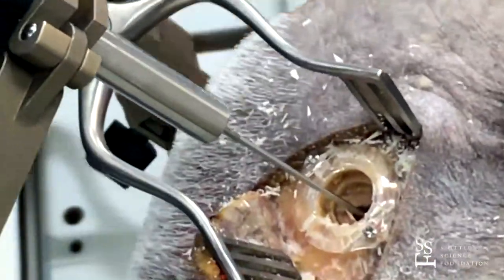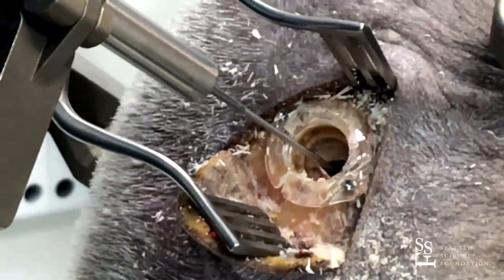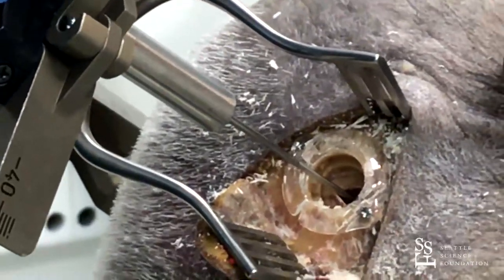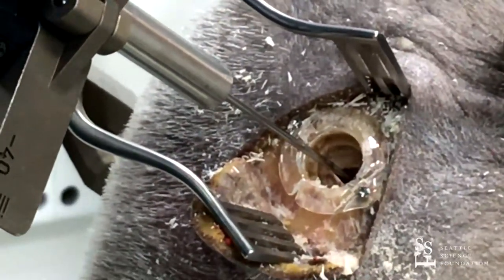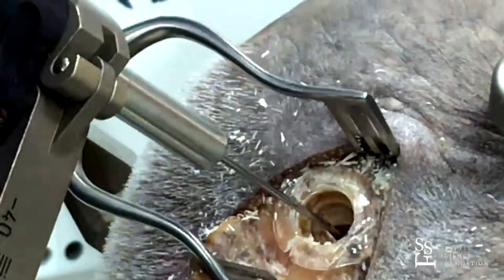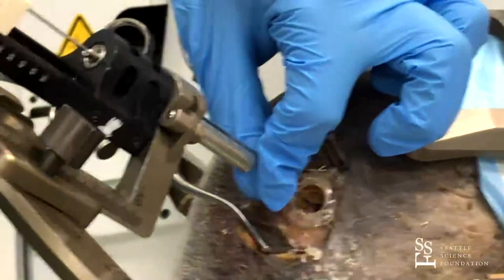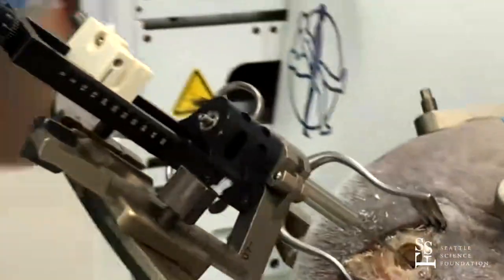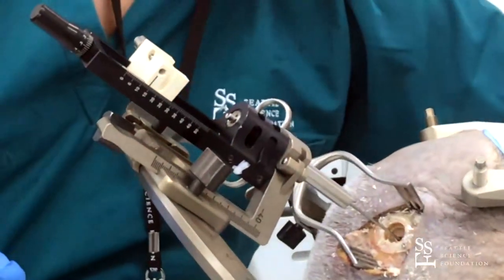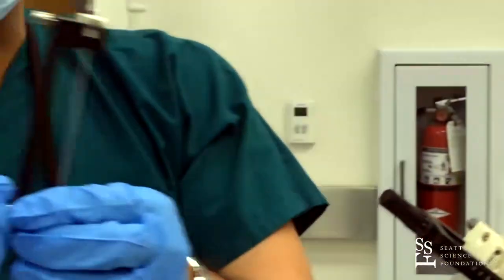Sometimes the pia can be like cellophane and can really deflect as we try to pass the cannula, so it's good to get sub-pial with electrocautery. Now that we're open, we're going to place our cannula to target. I'll usually use a Penfield one for this step and advance it further. When we do this with recordings or awake, the cannula will stop two centimeters above target. In this case I have the cannula going all the way to target because we're not recording. Now we're ready to place the DBS lead.